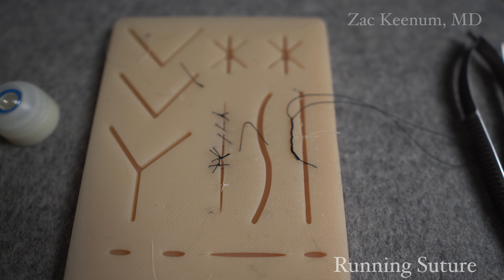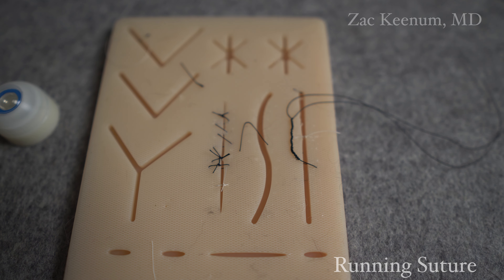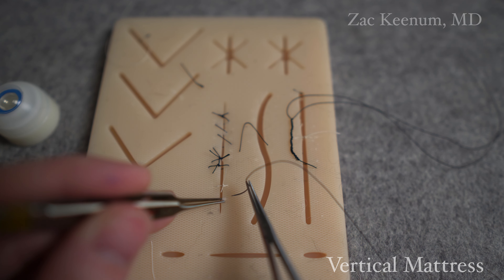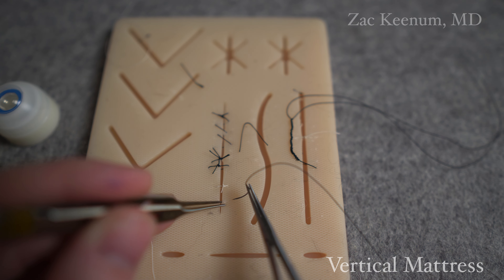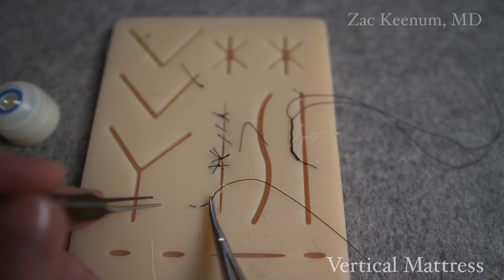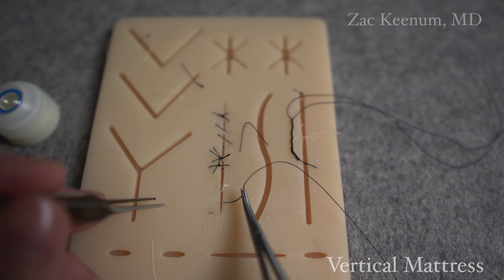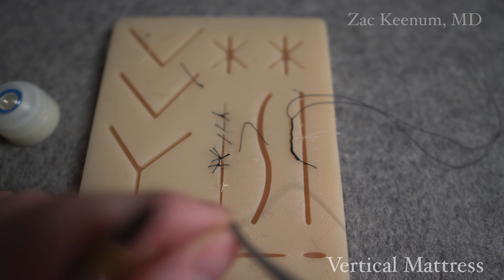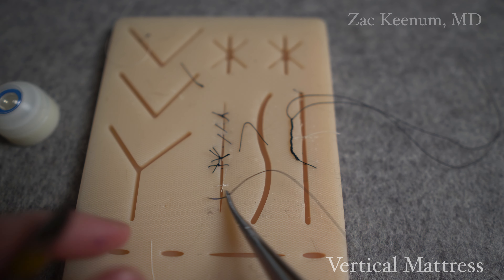Now I want to show you how to do a vertical mattress suture. A vertical mattress suture is great for getting good eversion of a wound - that's just really the way it's designed. You can do it a couple of different ways. It's all in one plane: it's a far, far, near, near - or near, near, far, far - but all in one kind of axis.